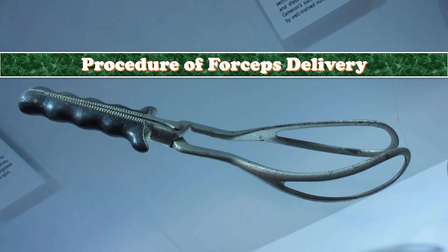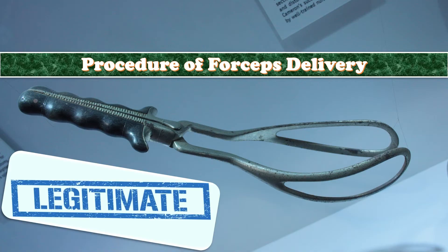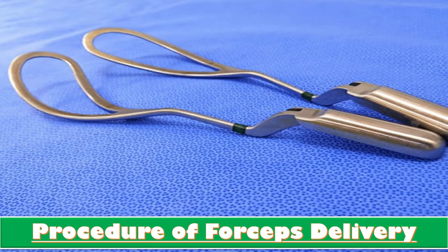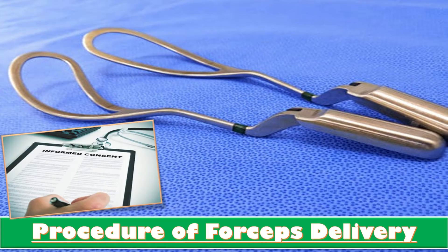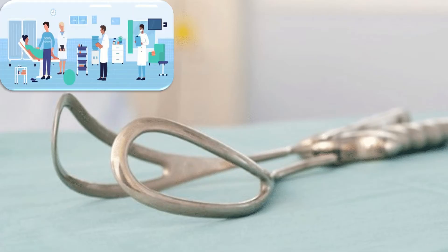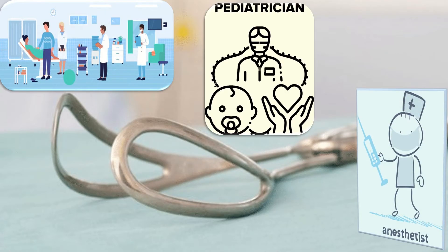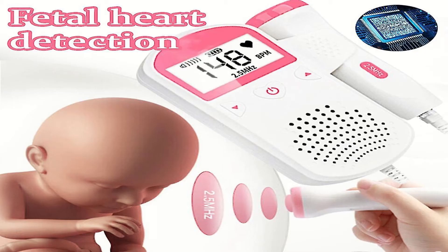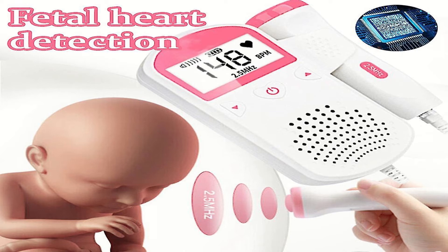For the procedure of forceps delivery, I will first make sure there is a legitimate indication. I will introduce myself to the couple, explain the whole procedure including its risks and complications, and take informed consent. After fulfilling all prerequisites, in the presence of senior staff, pediatrician, and anesthetist, I will proceed. I will check the fetal heart rate first because fetal viability is very important.